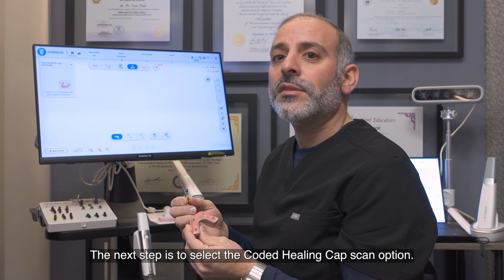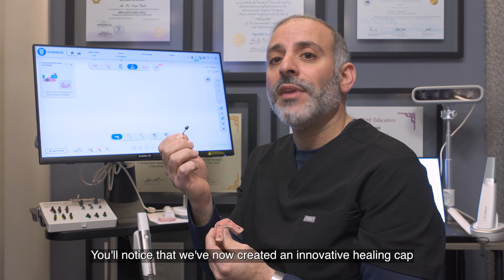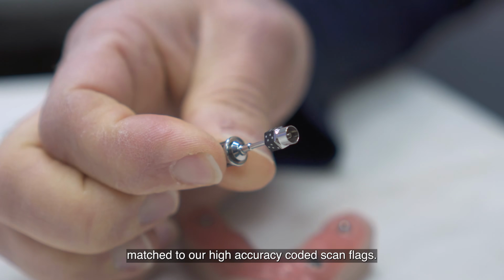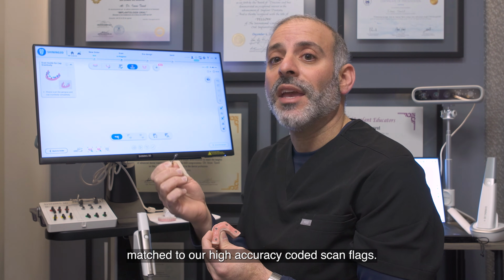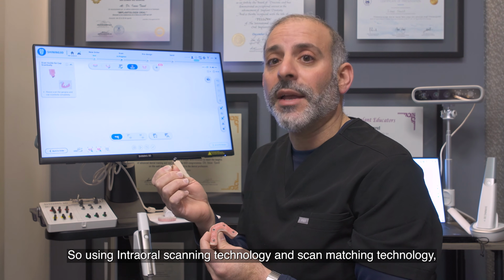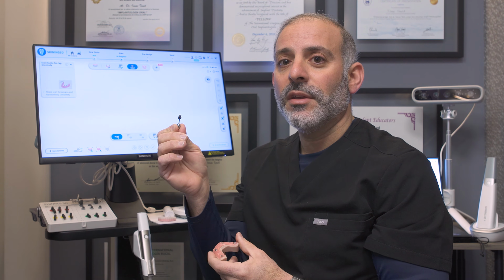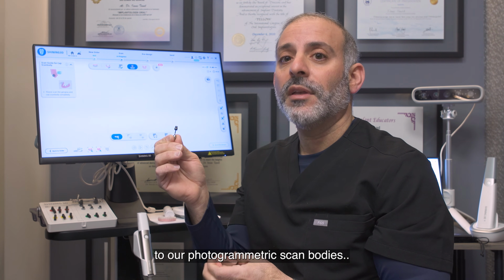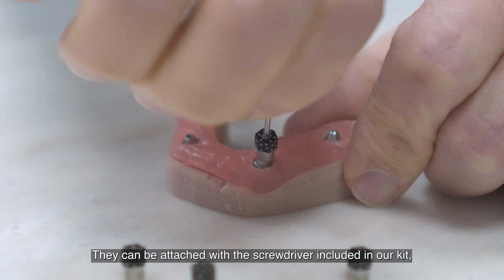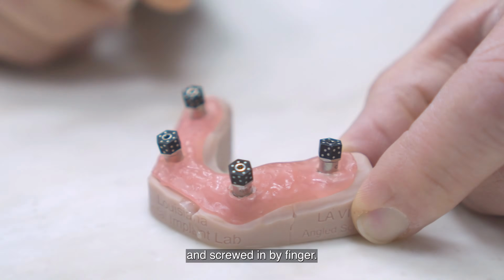The next step is to select the coded healing cap scan option. What you'll notice is that we've now created an innovative healing cap that can be automatically captured, matched to our high accuracy coded scan flags. So using intraoral scanning technology and scan matching technology, we are able to match these healing cap scan bodies to our photogrammetric scan bodies. They can be attached with the screwdriver included in our kit, or they can simply be picked up by hand and screwed in by finger.